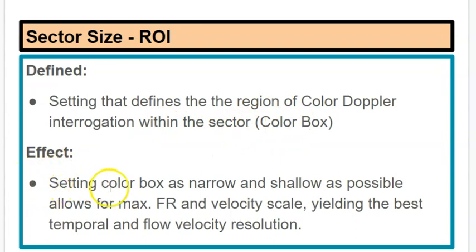And the effect that has is setting color boxes as narrow and shallow as possible allows for a maximum frame rate and velocity scale, yielding the best temporal and flow velocity resolution. Temporal means time, right?